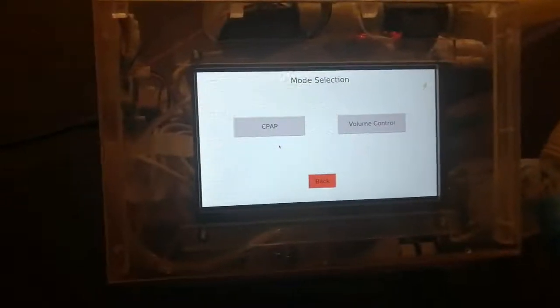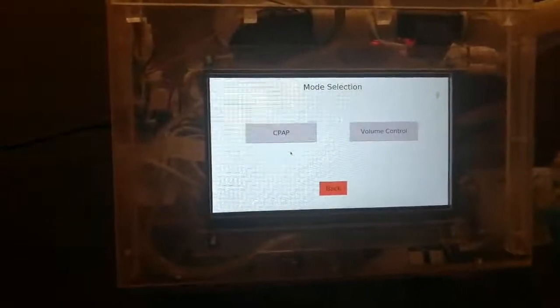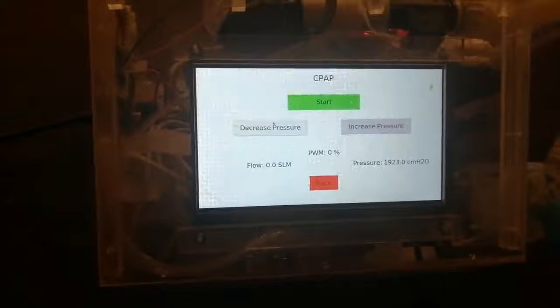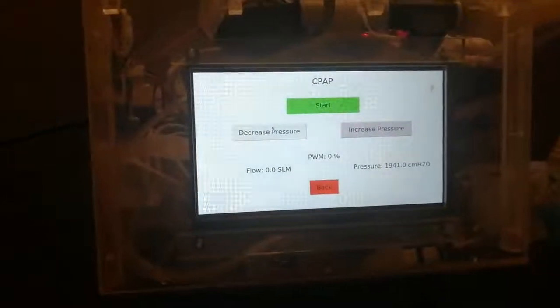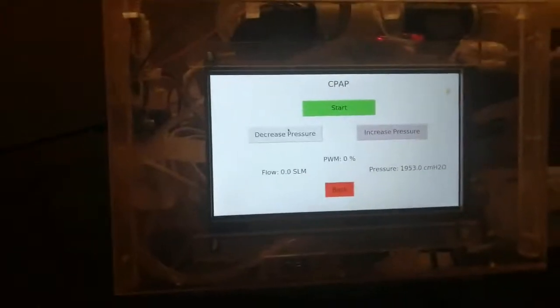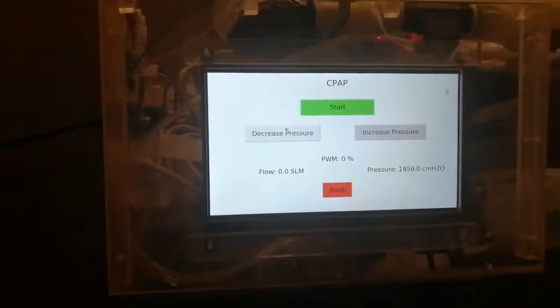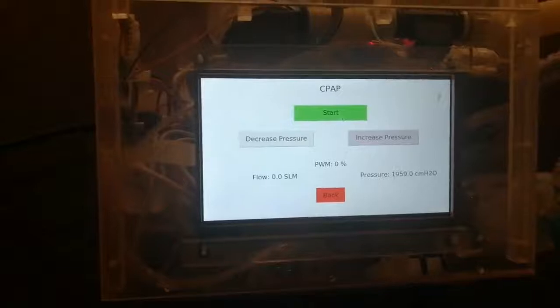In mode selection we have two main modes: CPAP and volume control mode. CPAP is the basic mode. Press the CPAP button. Here you can check the pressure values or modify them as well, and after that you can start.